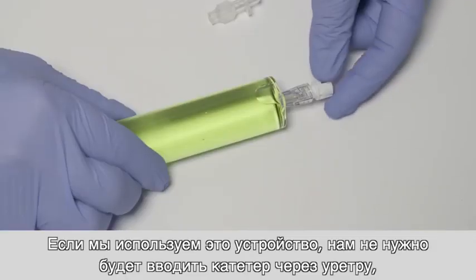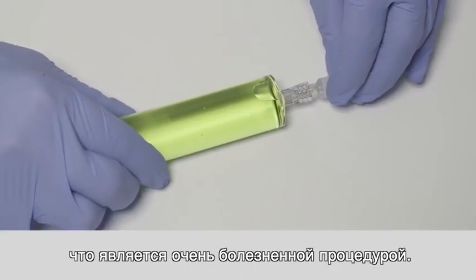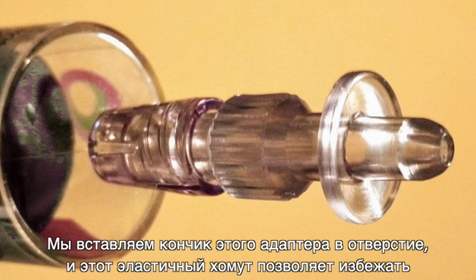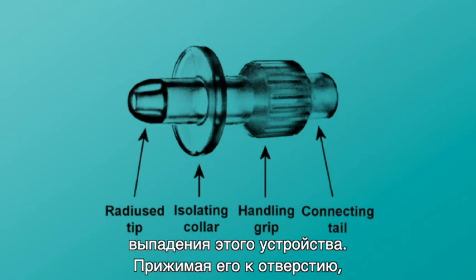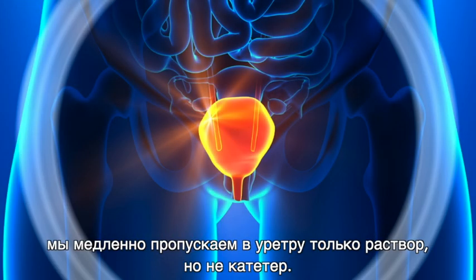If we use this, we don't need to put a catheter through the urethra, which is a very painful procedure. Instead, we put the tip of this adapter into the orifice, and this elastic collar makes the procedure drop-free. By pressing it against the orifice, we slowly let flow only the solution into the urethra, and not a catheter.